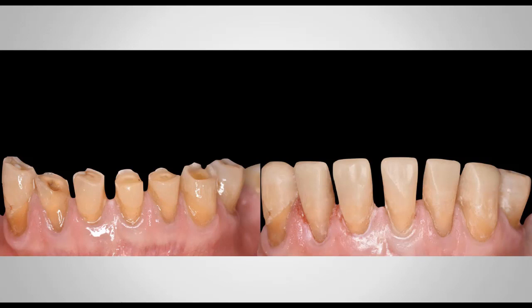And here's the case. This is a case that I worked on with one of my undergraduate students at the Dental College of Georgia. I cover sometimes there the clinic for restorative and esthetic dentistry, and you can see what we did for this patient. This patient was going to have multiple extractions on the maxillary arch, and she was going to end with a complete denture on the maxillary arch.